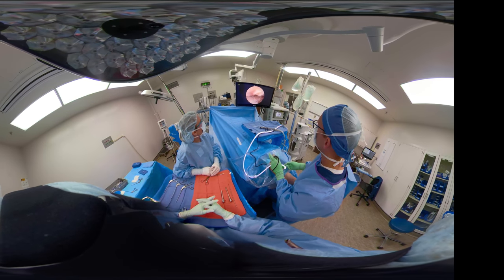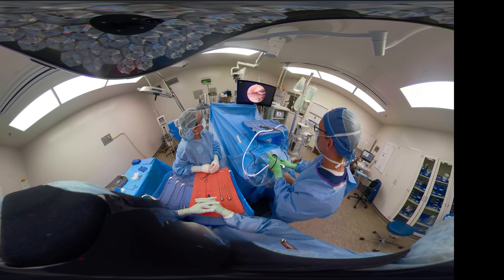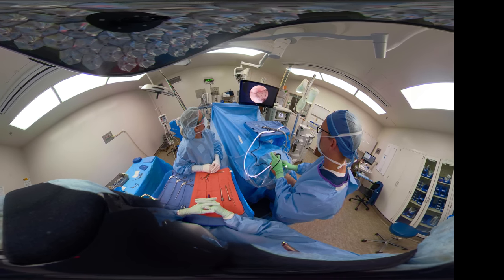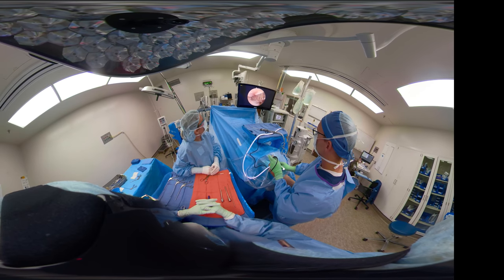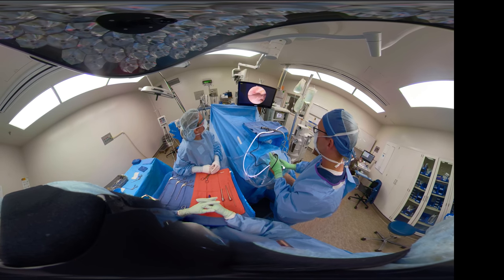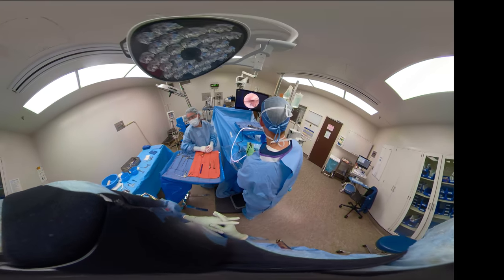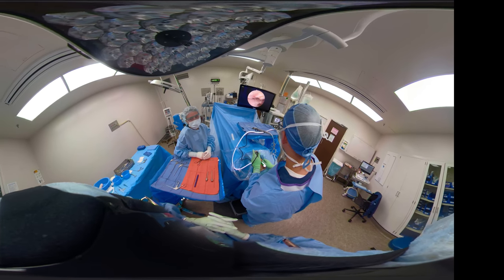So you can see where the light source is looking upward. And you do need to hold the scope down past the camera so you can use your fingers on that same hand to manipulate the scope, so you can use your other hand, your right hand, for probing and measuring. And we're now measuring what the size of that defect is. You can see it's down to subchondral bone, and we're looking at the size of the defect.